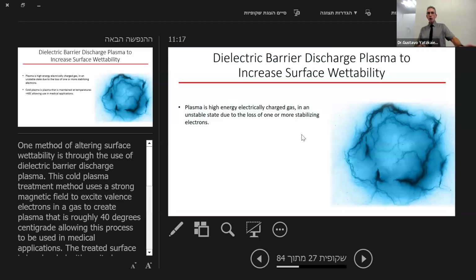In order to shift this surface from hydrophobic to hydrophilic, the companies are using some techniques. Some companies are doing this in the factory using nitrogen or using salts. And other companies have tried to do this in devices that you can use in the clinic. When we want devices that we can use in our clinic, there are some different techniques. We can change this surface using plasma, argon plasma, or ultraviolet radiation.